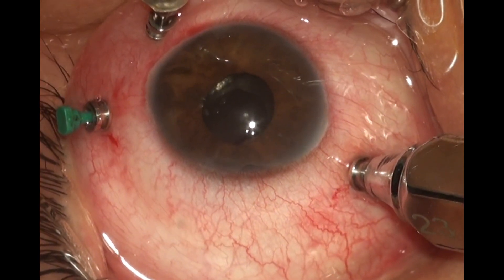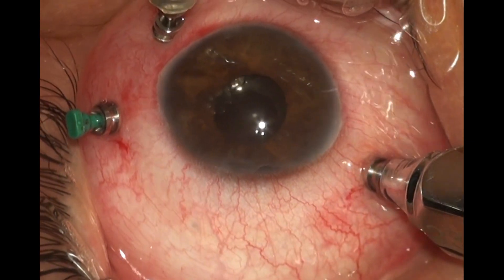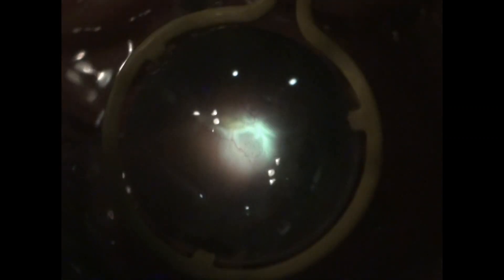The patient was a young myope who had been previously operated and silicone oil had been injected. Here we have removed the silicone oil, and if you see the surface of the retina, there's plenty of scar tissue on the surface of the retina, or PVR membranes as we call it.